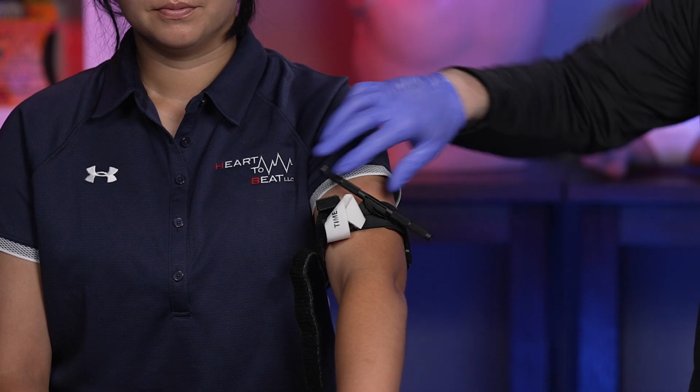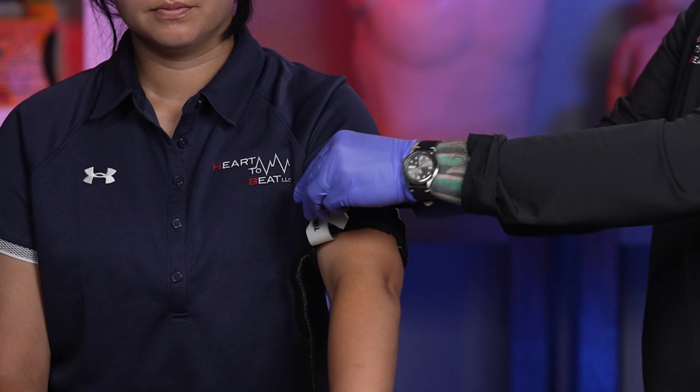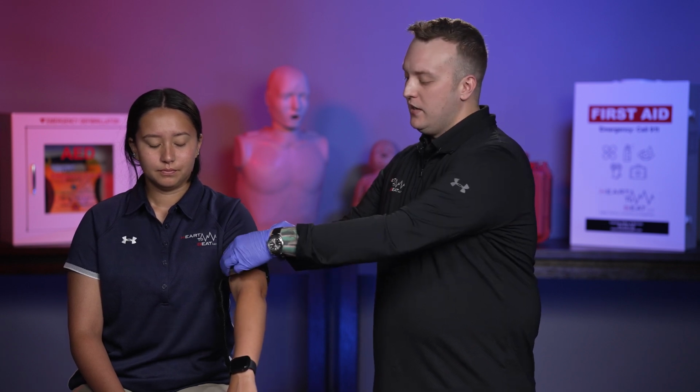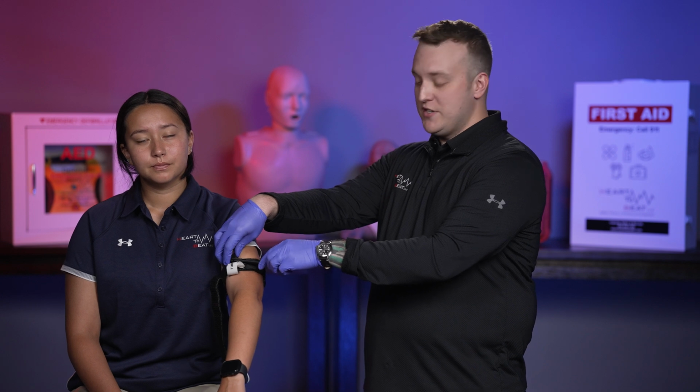Once we have it very tight, we're going to go to the rod on top called the windlass. As we spin this, it creates more tension and applies more pressure against the arm. We'll spin this down and we'll also look at the site that's bleeding. As we spin this, we want to see that bleeding start to slow or even stop.